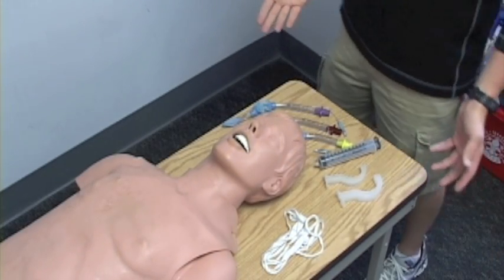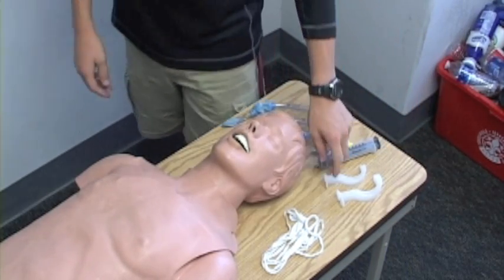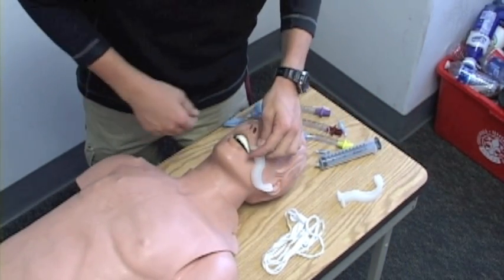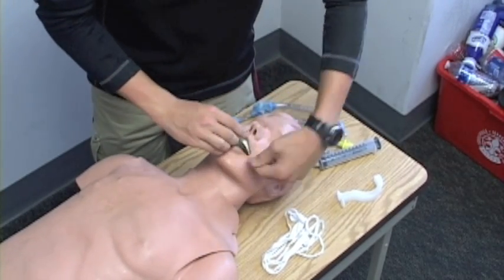BSI seems safe. We begin by inserting an oral airway for my patient. We're going to measure it from the mouth to the ear. We're going to do a cross-finger technique, insert it upside down, and then rotate around until it's right there.